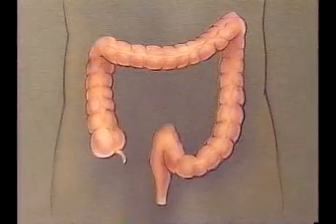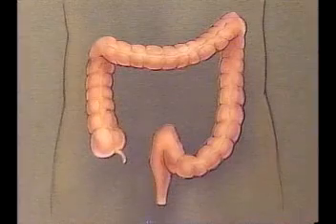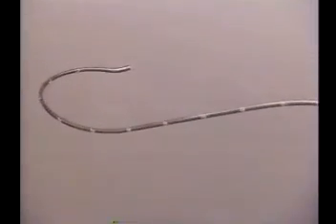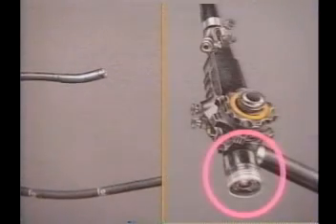As you can see, however, the colon isn't straight. There are several bends and turns between the cecum and the anus. Your physician will perform a colonoscopy to examine the inner lining of the colon. The instrument he or she will use is called a colonoscope. It is a flexible tube, slightly narrower than a garden hose, and about 5 feet long. One end has a lens in it, and the other end an eyepiece and controls.